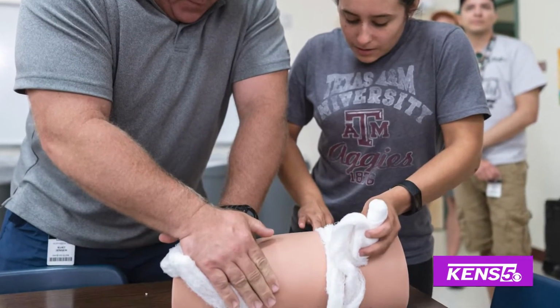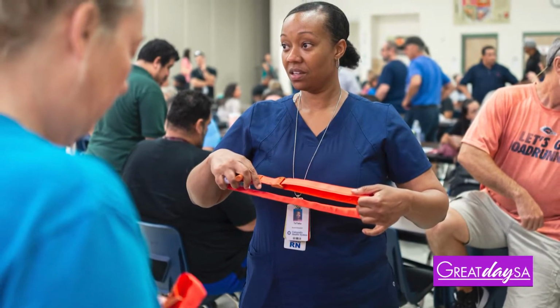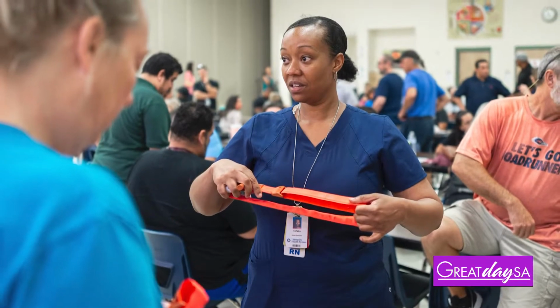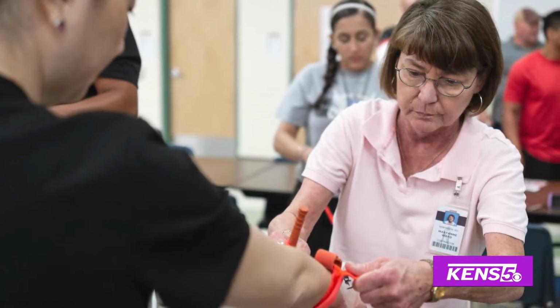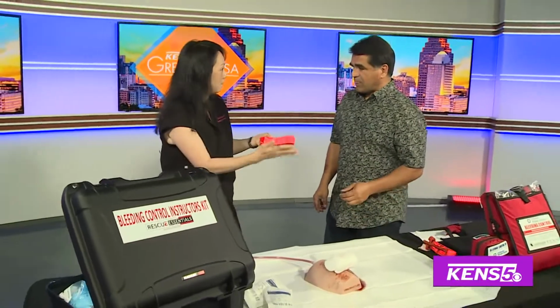This is great because like I said, I was thinking, what would I know how to do? Okay, there is another technique though too, right? There is, and part of the course we're going to show you how to use a tourniquet. If someone is bleeding from an area that's an arm or leg, and this can happen if someone's out on the trail, they're biking, they fall, and now they've broken their arm or their leg, and there's a cut and it's bleeding, right? So same thing, ABC, and you put the tourniquet on.